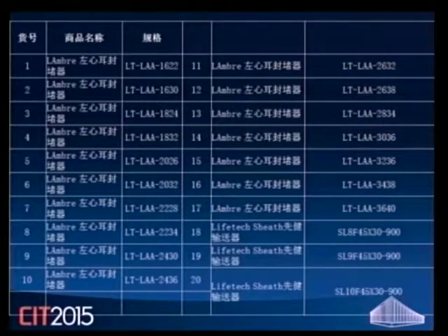So we have the maximal diameter of the orifice of 24 millimeter. And if you look on the list, can you see the list on the screen? Yes, we see it. The next slide, the following part of the list.